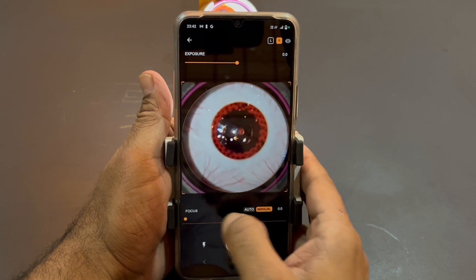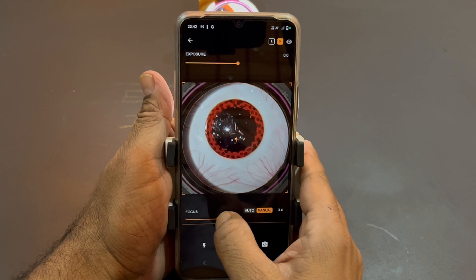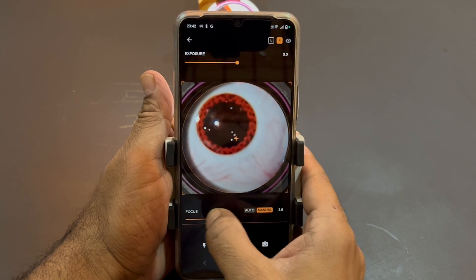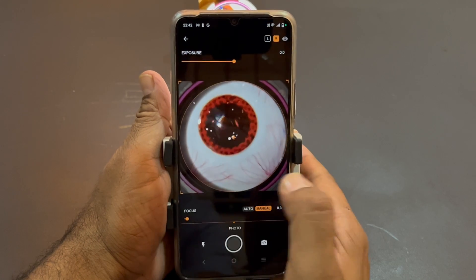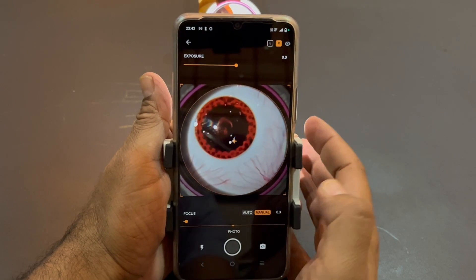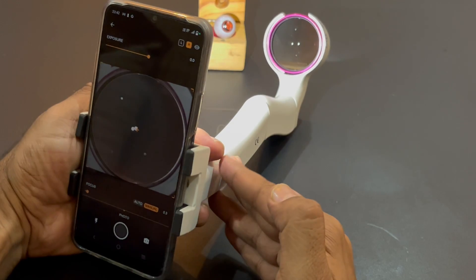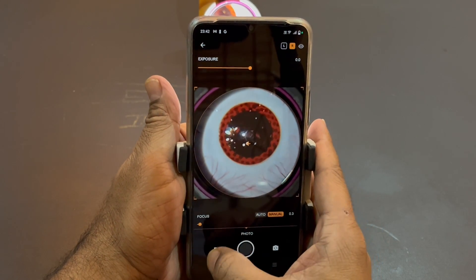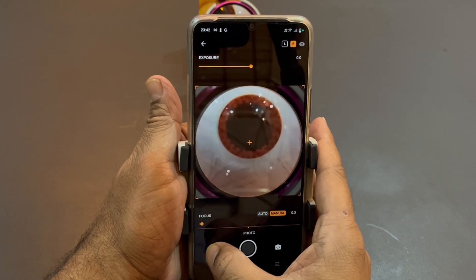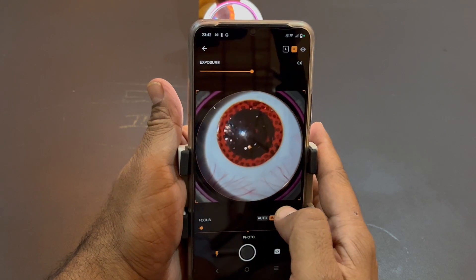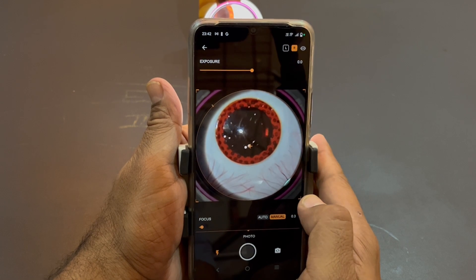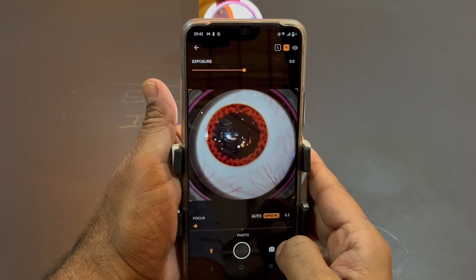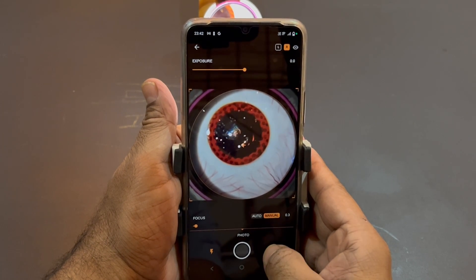In that case, switch to manual focus. With the manual focus slider you can drag it to fine-tune focus across different areas. You can see this is working — those vessels on the model eye are clearly visible. Also, the light switch should already be on. If it is not switched on, just click the button to turn it on, because we always need light to illuminate the fundus.